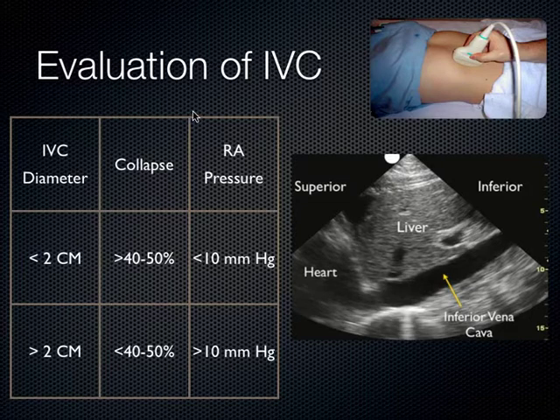So first off the bat, where do you stick the probe? You put it right here along the parasagittal to the right in the sagittal view. So we have the indicator of the patient's head in sagittal view, and I say right parasagittal. What does that mean? Sagittal means right down the center of the body.